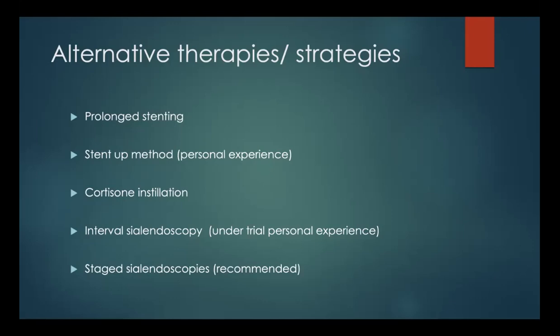We have done cases where initially just a 3 French stent could go in, and over a period of 6 weeks, we put in a size 8 French. Now that really provides quite a good dilatation, and this is just from personal experience. There's no literature supporting this, but it seemed to work quite well.